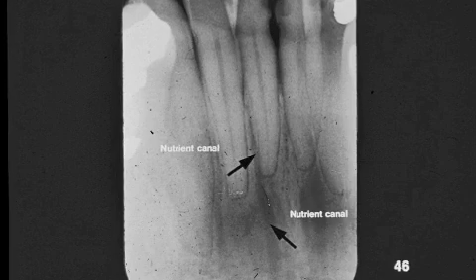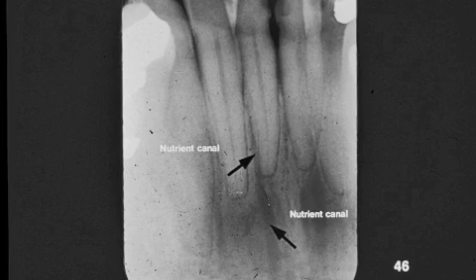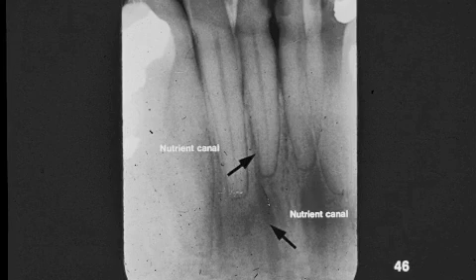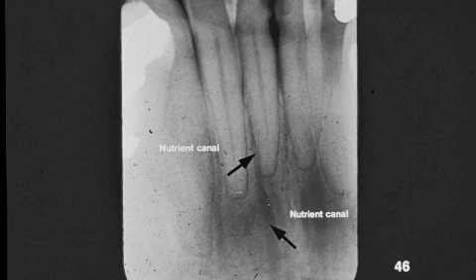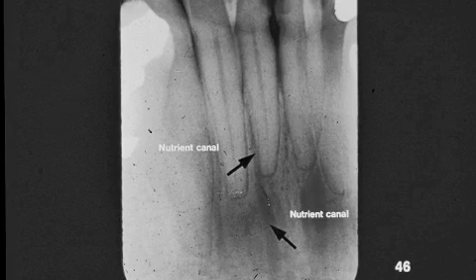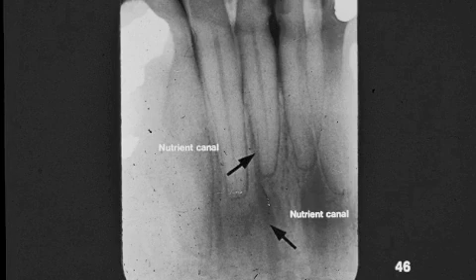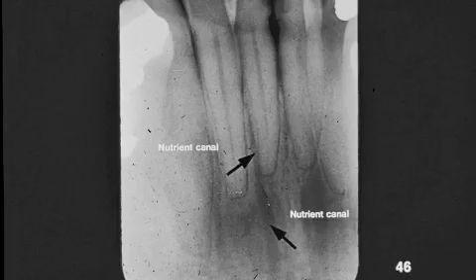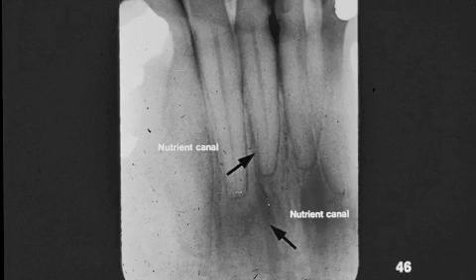Nutrient canals provide nerve and blood supply to the teeth and to the bone. They can be seen in any x-ray. This is a great example. If you look closely, you can see other nutrient canals on this slide.